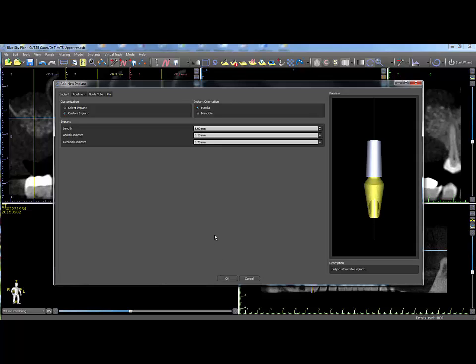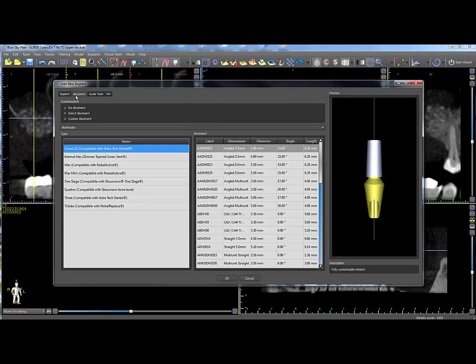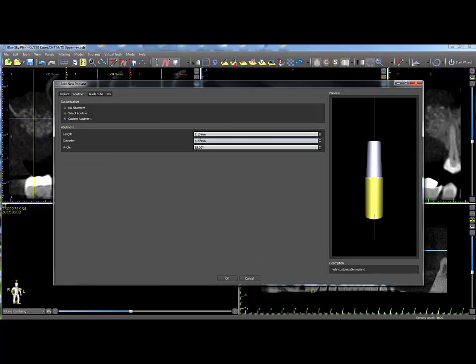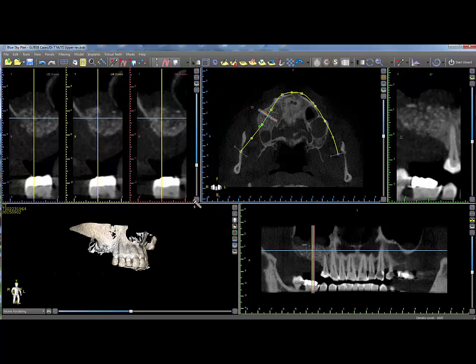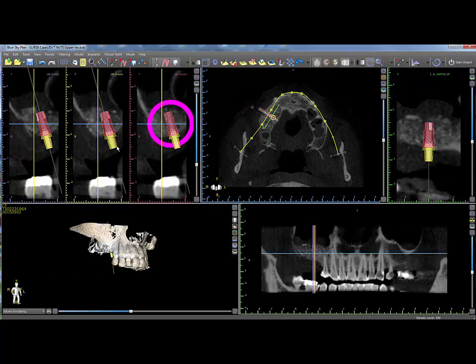To add a custom abutment, click on the Abutment tab, select Custom, and enter values for length, diameter, and angle. Click OK to place the implant with the custom abutment.